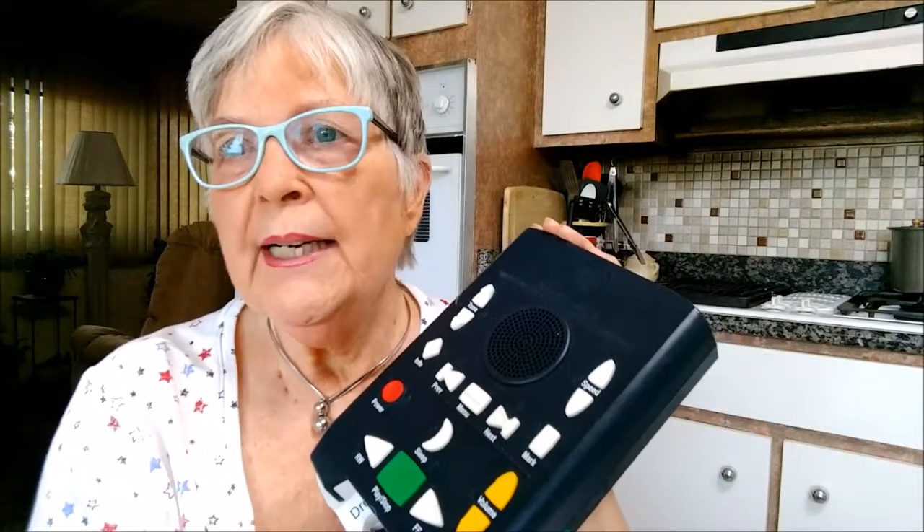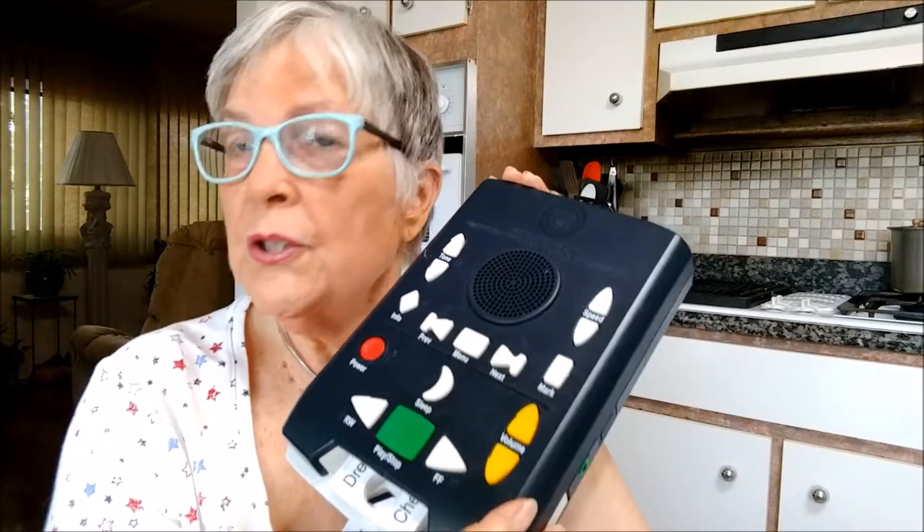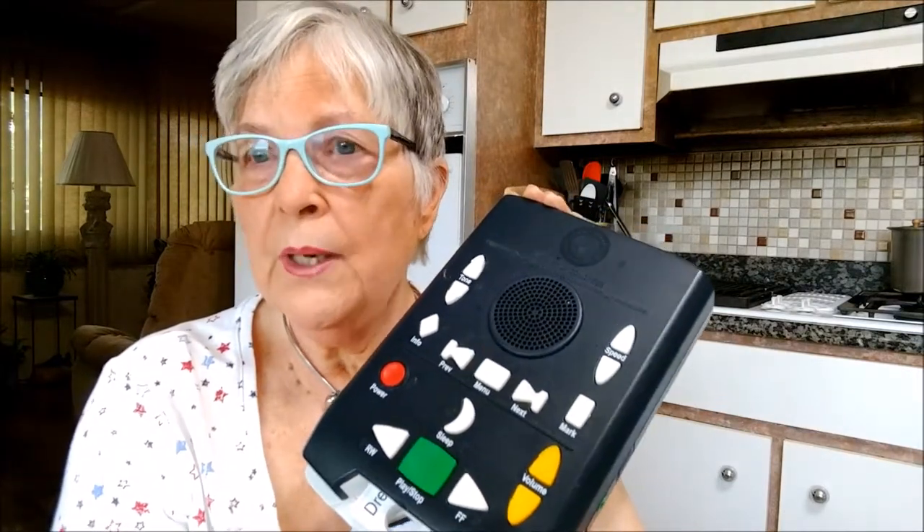They've been around a long time, and through them they have provided for vision-impaired people for at least the last 30 to 40 years. This is their latest, newest technique, which took them about 10 years to develop and is quite sophisticated.